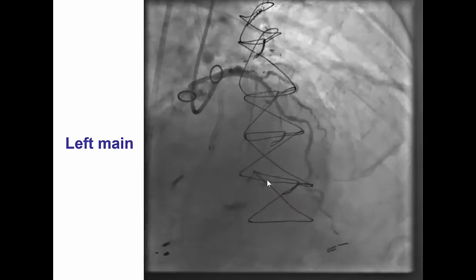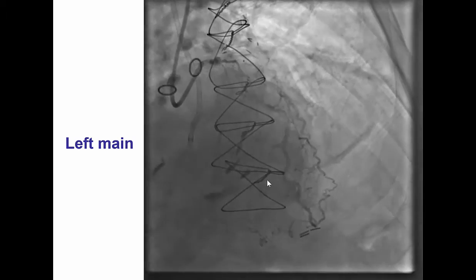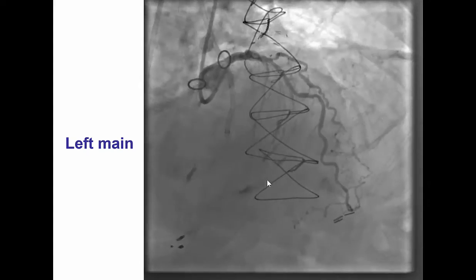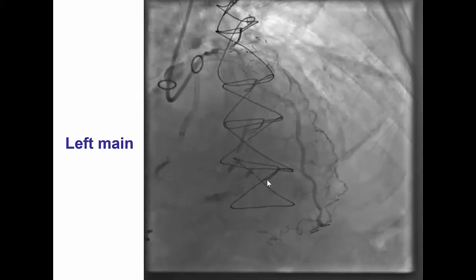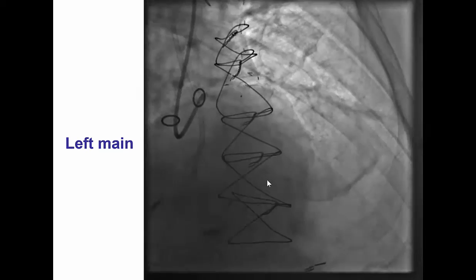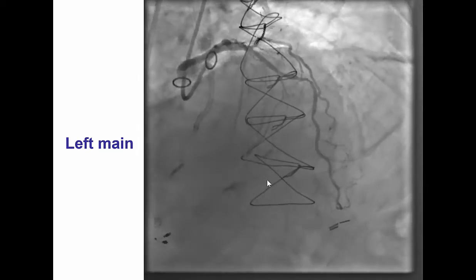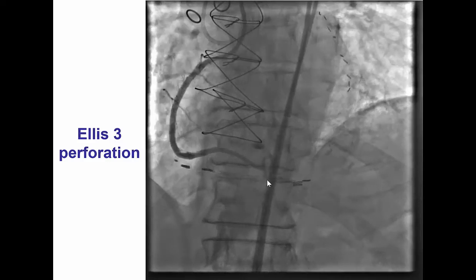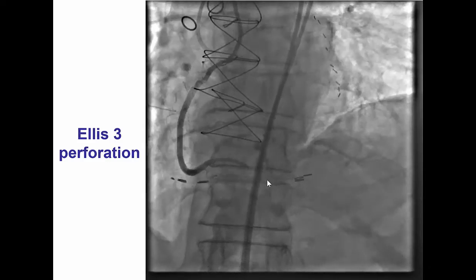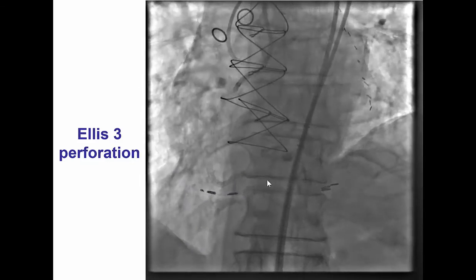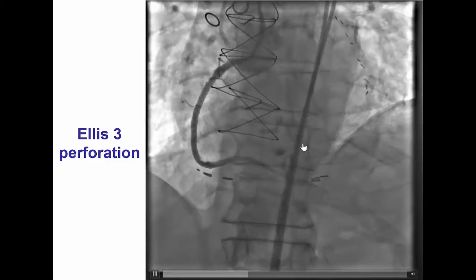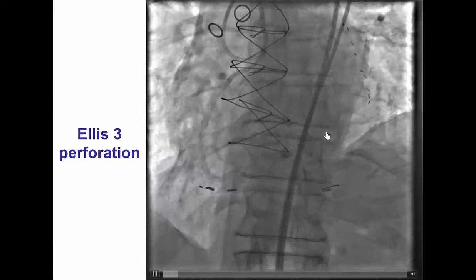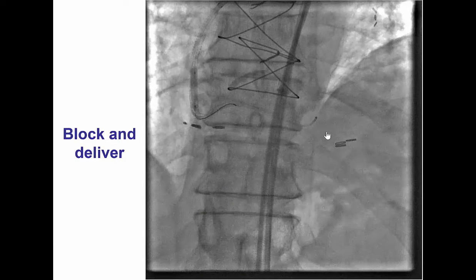We did an injection of the left main to ascertain that we didn't have any injury in the donor vessel. However, the left main was unchanged from before. A picture from the right demonstrated that there was now free flow into the space where the perforation had occurred.